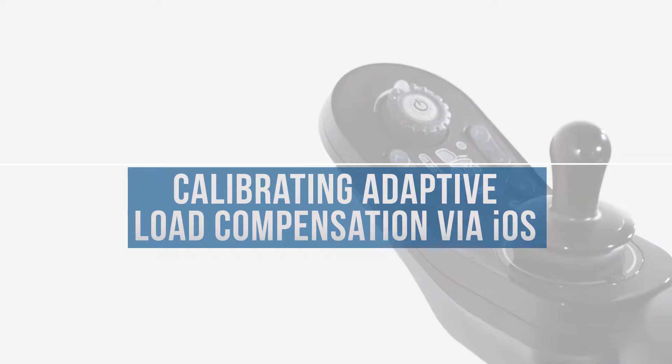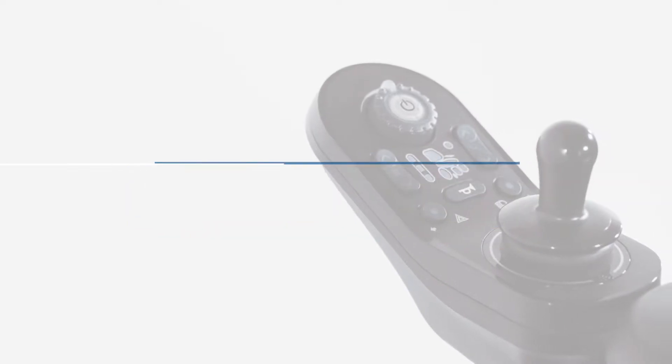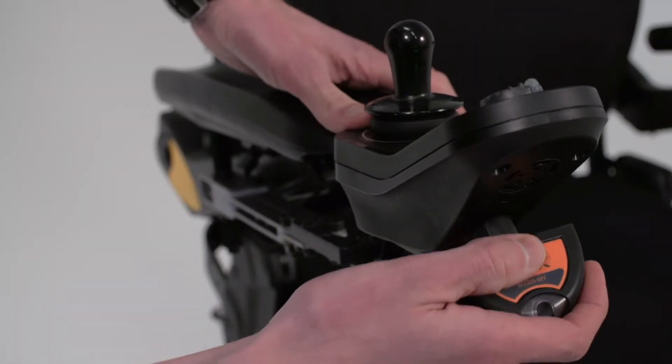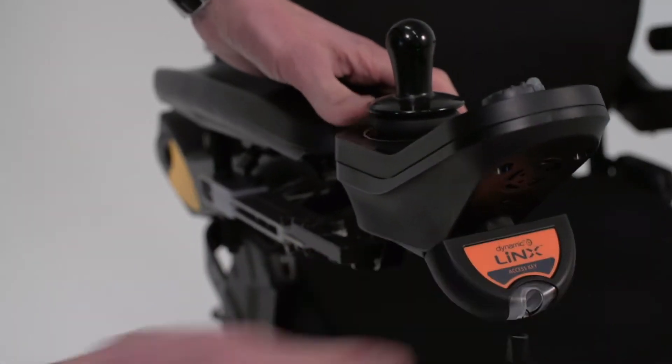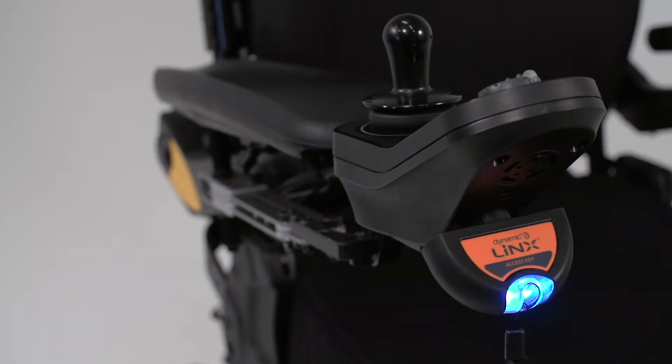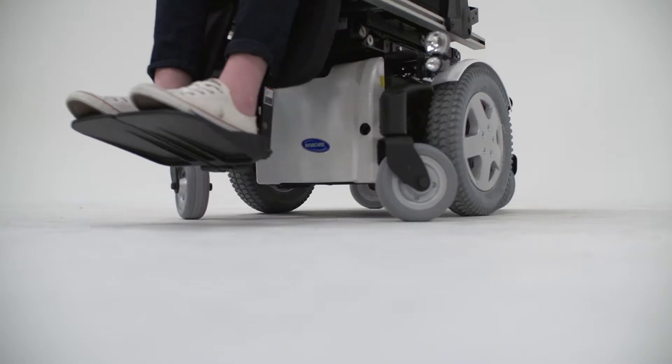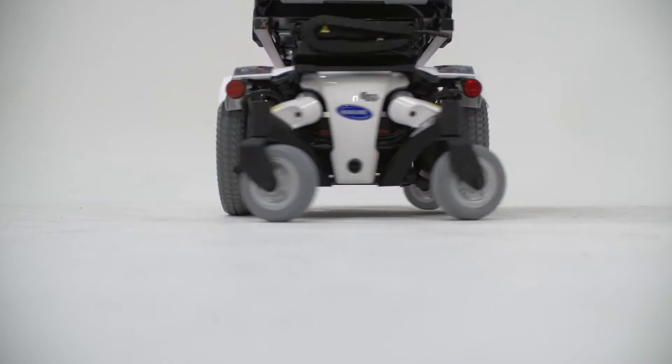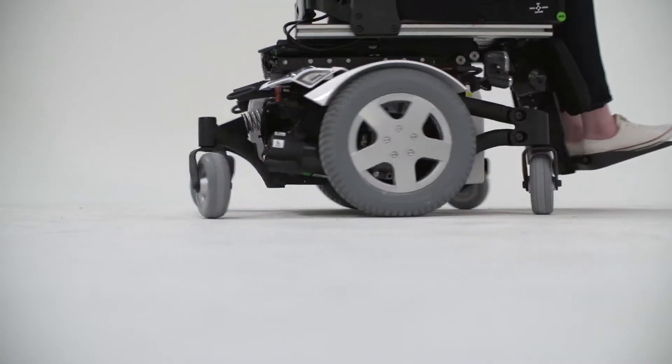Calibrating adaptive load compensation. The Lynx programming tools can be used to maximize the drive performance of the power chair by calibrating the adaptive load compensation following motor replacement.